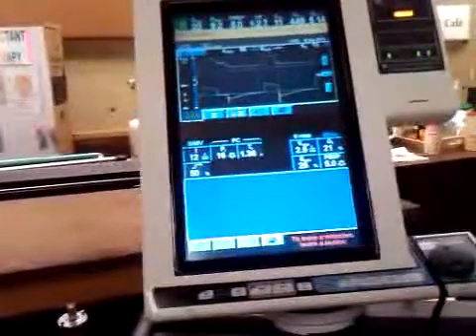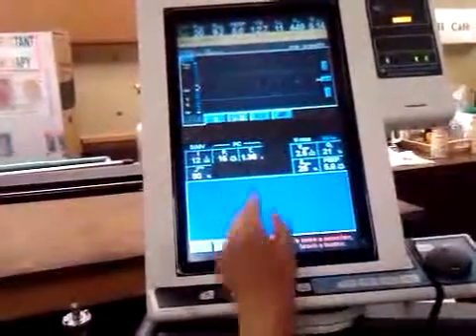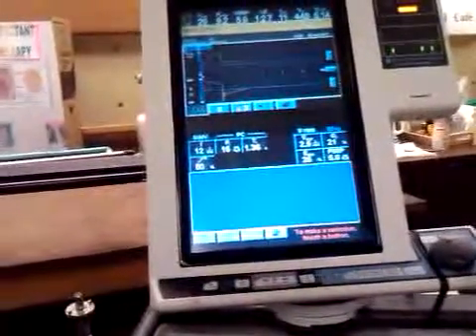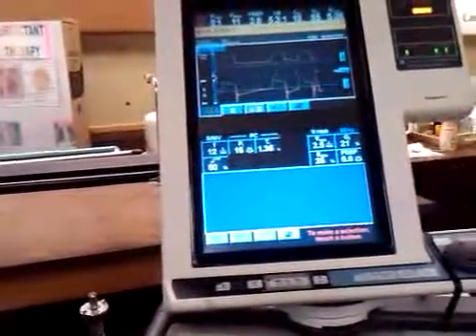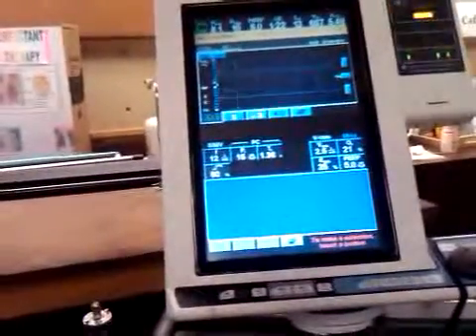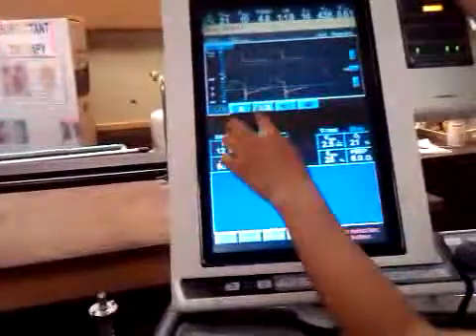How do you physically record something on my little computer? What you're going to do on SIMV, you need somebody breathing for you, but we don't have that, we need somebody breathing for us. And Jolene's on the phone. Always get your parameters when it's on an S. I don't have one? Oh, okay. I just had the recording that you gave me. So go to your clipboard, okay? Yeah, I think I know.